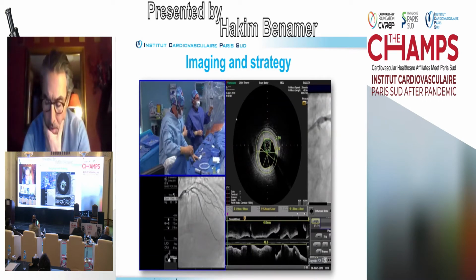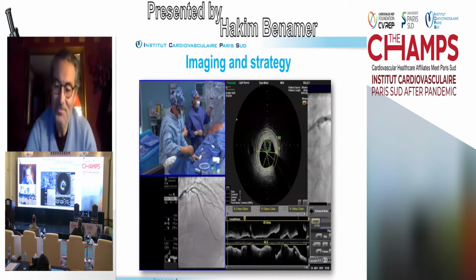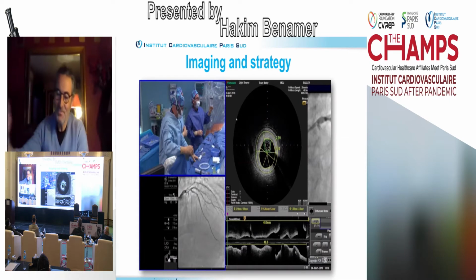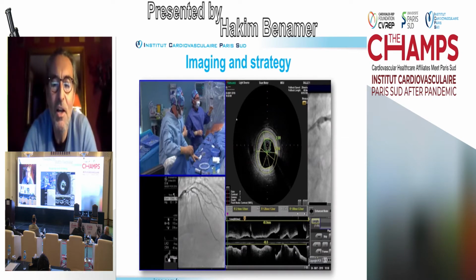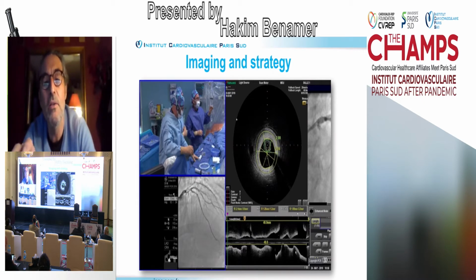My question, Dr. Hakim, please. You selected an OCT, and OCT needs a lot of contrast, and your patient has a renal impairment. Why didn't you use an IVUS in this case? Yes, it's a good point. We did only one OCT for this case because of this renal insufficiency, of course. But for this live case, we wanted to be very educational for this decision and the strategy making.